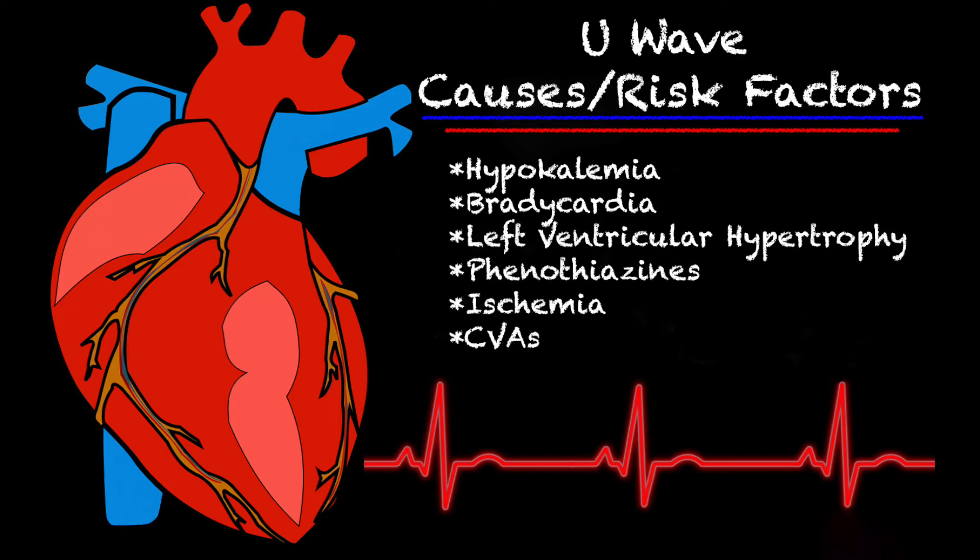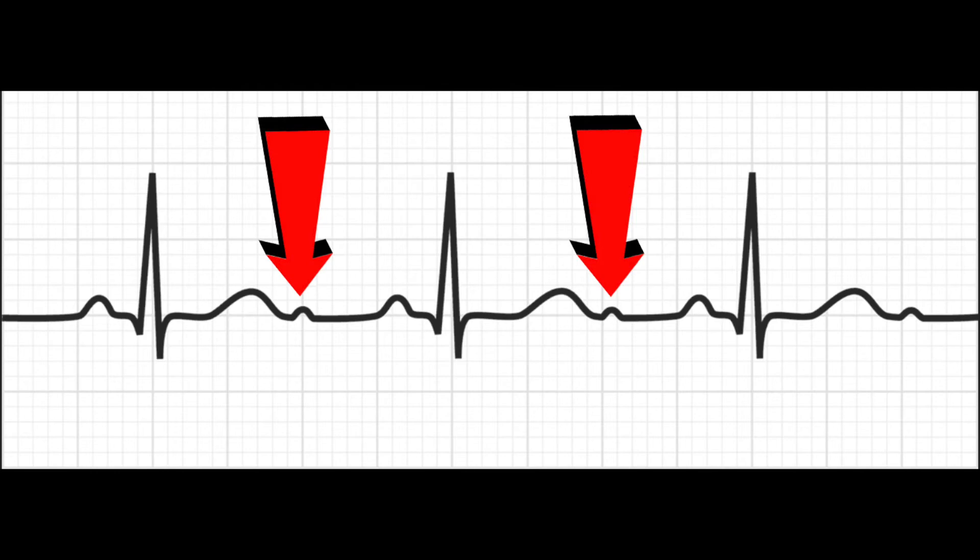Let's take a look at U-waves on a strip or on an EKG. This is a really clean illustration of a U-wave. You have your P-wave, your QRS complex, your T-wave, and then the U-wave — and you'll see how tiny that U-wave is.